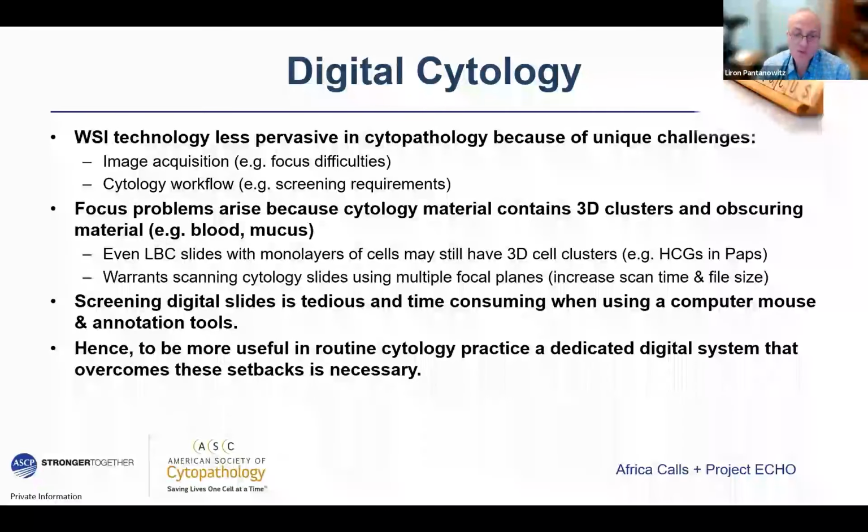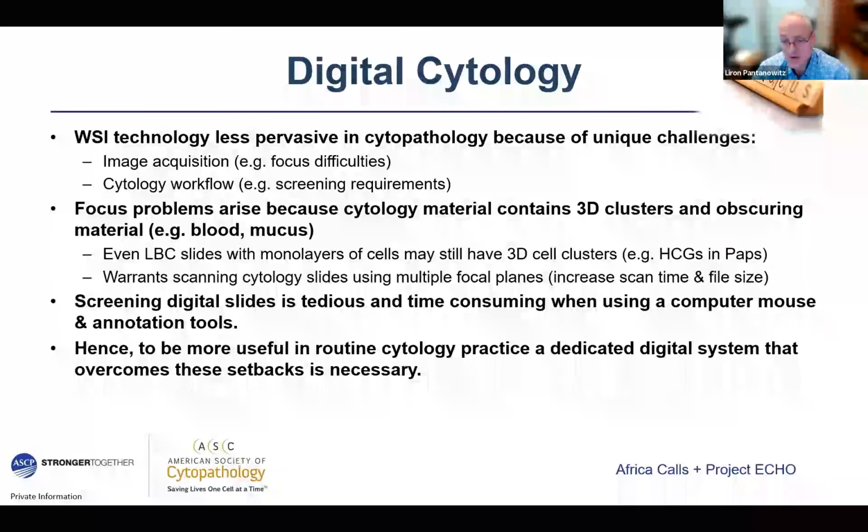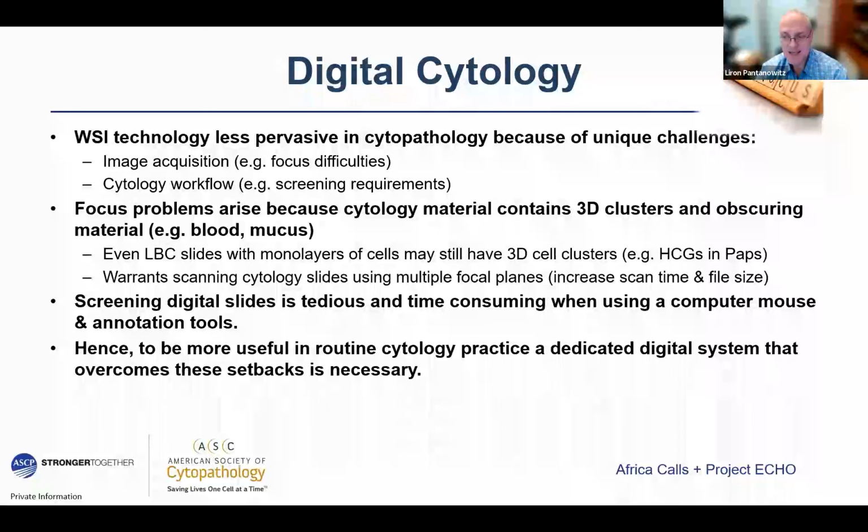So if this has to be useful for us in everyday routine practice, we need a dedicated system that's going to fix these problems, which is help us get a good image, everything in focus, and it makes sense for us with the kind of workflow we have, which is screening cases before we interpret them.